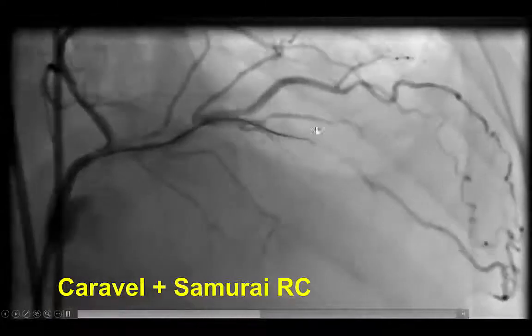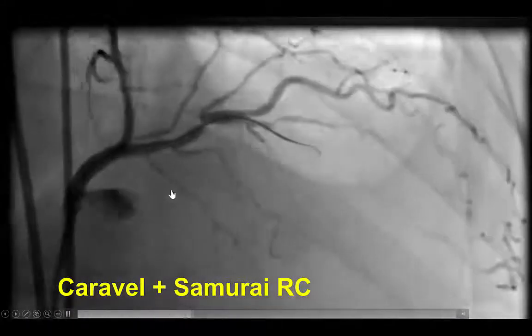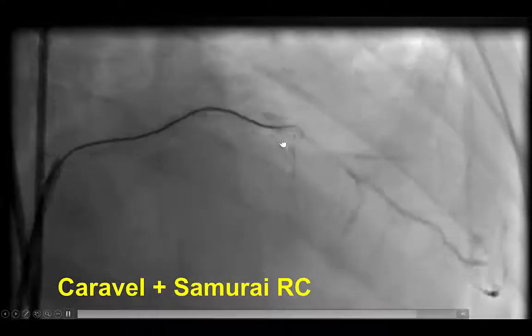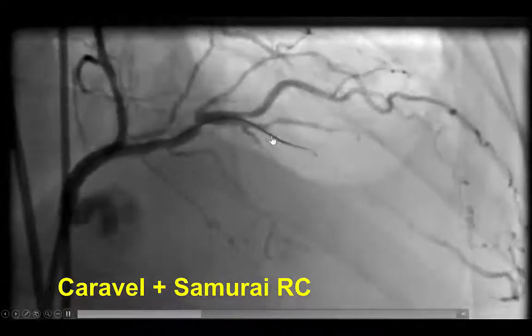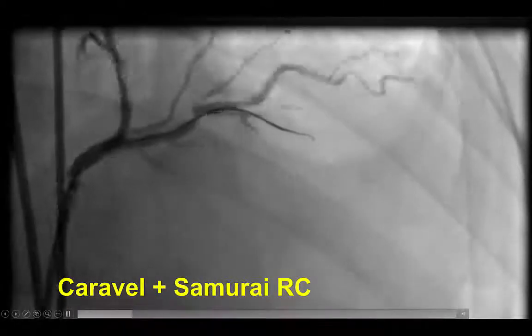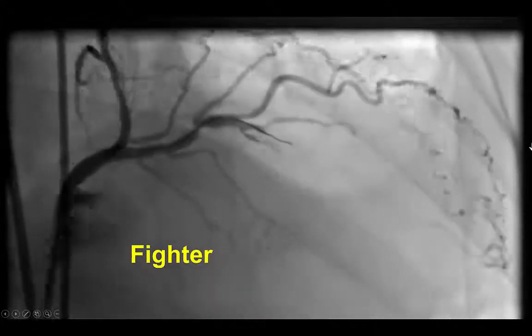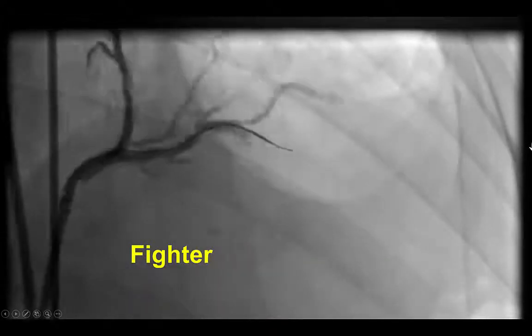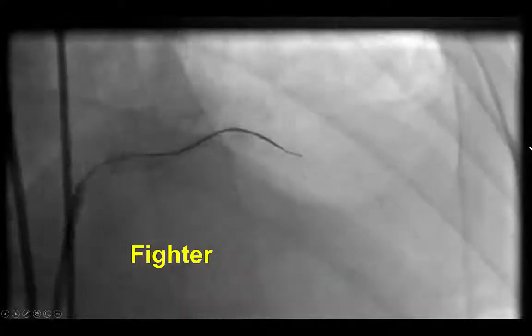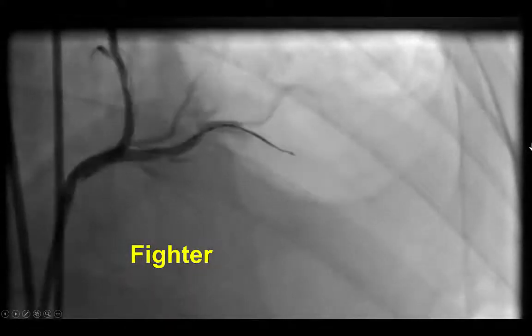In this particular case, we advanced a Corsair microcatheter with a workhorse Samurai RC guide wire to get into the lesion. Interestingly, the wire seemed to move in the right direction, so we attempted to advance it further. However, it would not advance past a certain point. We then switched to a Fighter, a tapered polymer-jacketed guide wire, which also attempted to cross but was stopping in this particular location.